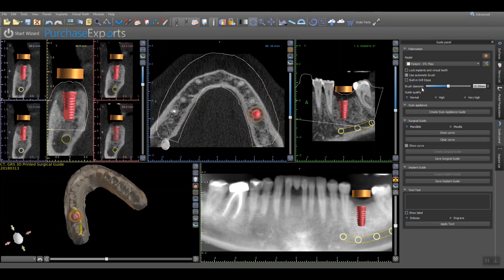The guide quality can also be adjusted, with a default setting of normal and additional settings of high and very high as options that will increase internal detail of the surgical guide based on the anatomy of the STL virtual model. Typically, the normal setting will provide for an unencumbered path of insertion and removal as printed, requiring very little post-printing processing.